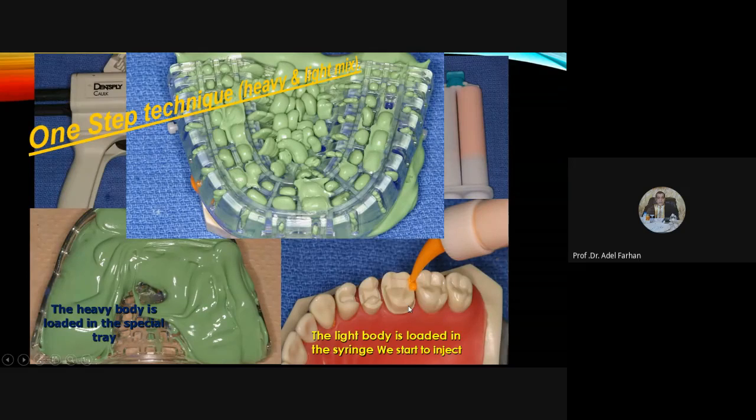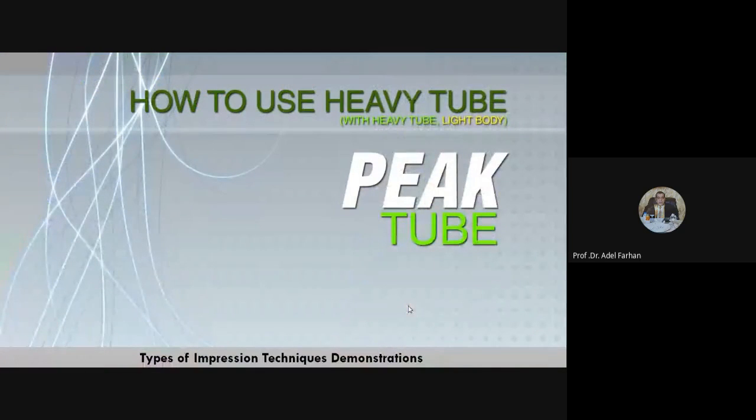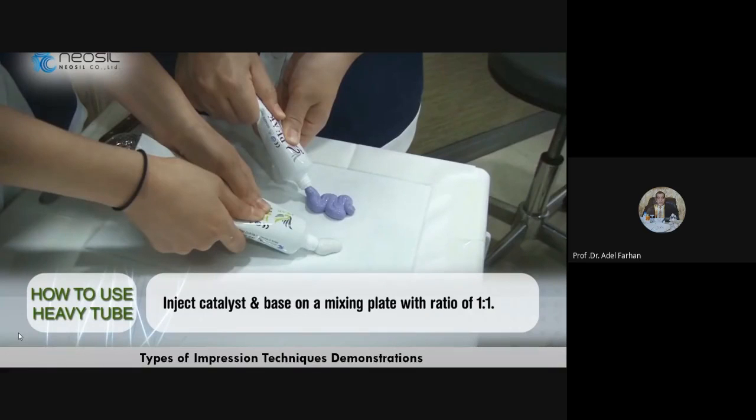You will seat it over the light material. صار عندنا طبعا بهالطريقة الهيفي، لأن الفيسكوسيتي مالته عالية، راح يدفع اللايت لأنه الفيسكوسيتي مالته قليلة intimate contact with the detail of the dental arch. بهذه الحالة راح يعطينا impression مضبوط. يعني عندنا ماتيريال قوية وماتيريال ضعيفة، القوية راح يدفع الضعيف باتجاه البريباريشن والدنتال ارش، وكل ما يكون كونتاكت وتابيلتي ويا الاريا اوف دنتال ارش عاليه، كل ما يعطينا ديتيل للامبريشن عالي.